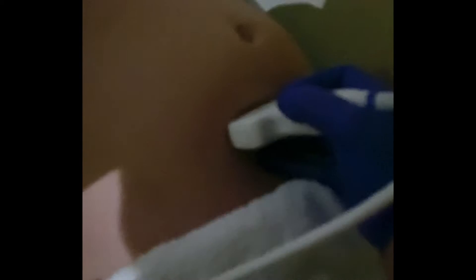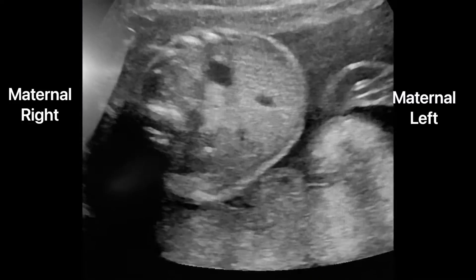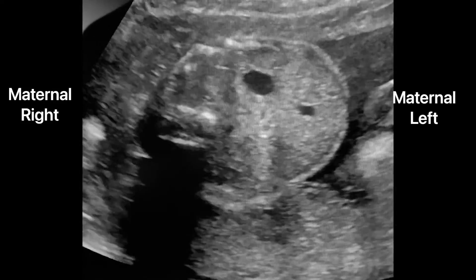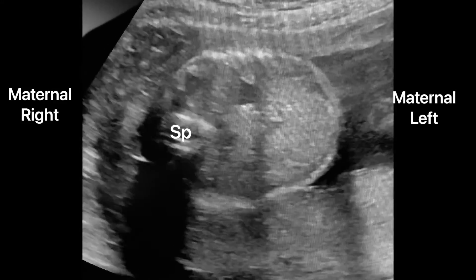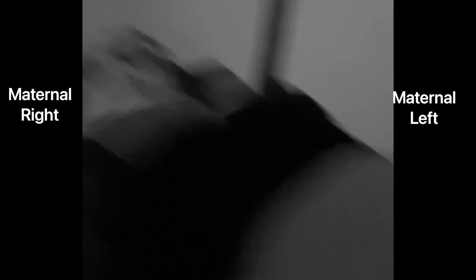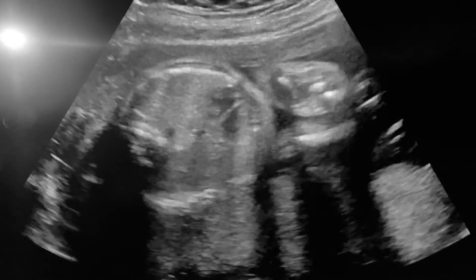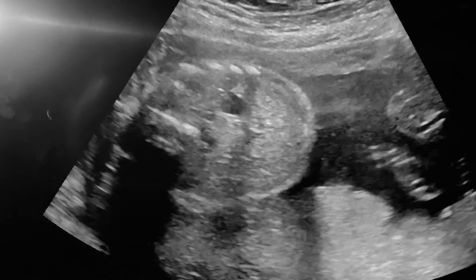Here, I'm transverse on the abdomen. You've got the fetus in transverse — the stomach anterior, the spine to the left. That means the baby's head is going to be down this way. Scan down — there's the head. Scan up. Again, stomach and spine to the left of the screen. Here I'm in sagittal, and remember the baby's vertex — head down. So mom's longitudinal, baby's longitudinal. Now here the baby turned and the spine is facing the anterior uterine wall, but the fetus is still vertex or cephalic.